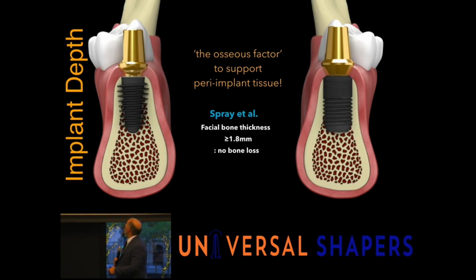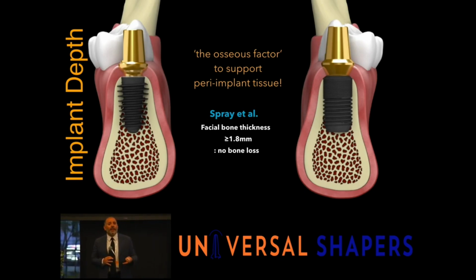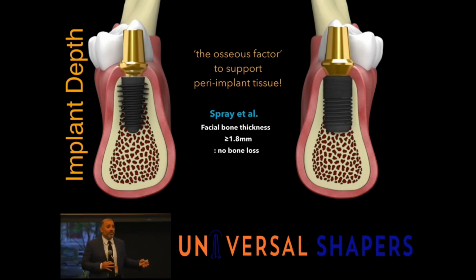versus an implant that has less of a tapered design at the crest. So we'll try to pick those. Why? Because it gives us a way to cheat. By having the thread start a little bit lower down, we can cheat and now have a narrower neck at the top and have more bone for us to place the implant, which is great.